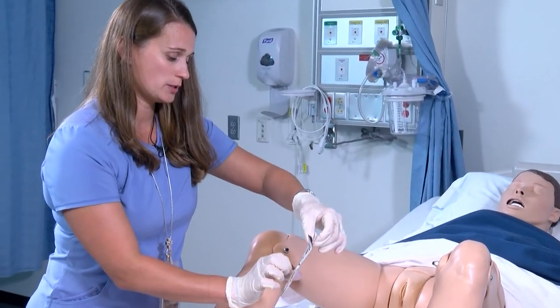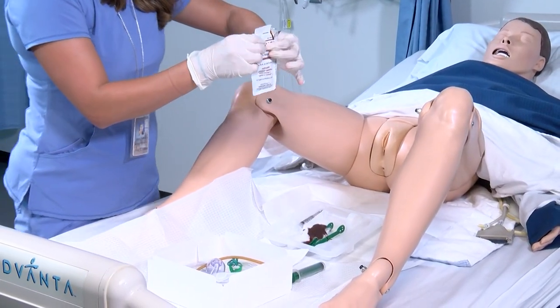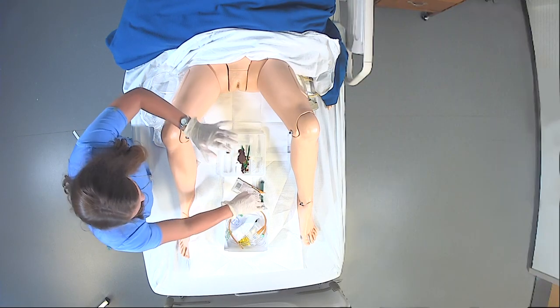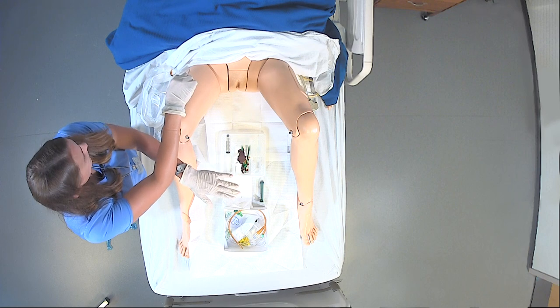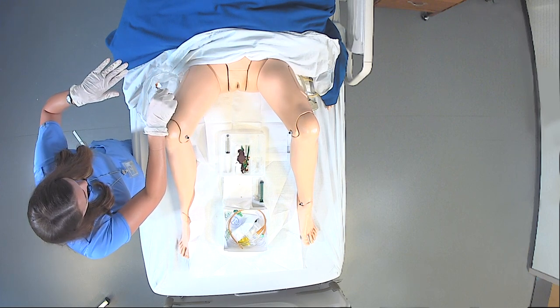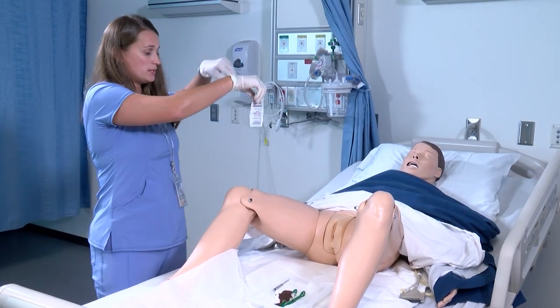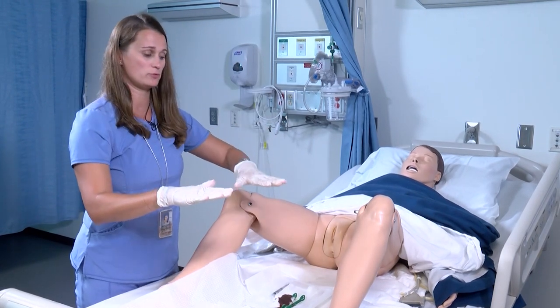When you place your iodine into the container, a common thing people like to do is put the empty bottle in the trash. There are two ways to do this — you can leave it on your sterile field because it is still sterile, or you can place it in the trash. But you need to make sure you're not crossing over your body or arm, and that your hand stays high enough above your waist so you're not placing your hand into the trash and contaminating your gloves. Drop the trash item from high so you are not even close to contaminating yourself.